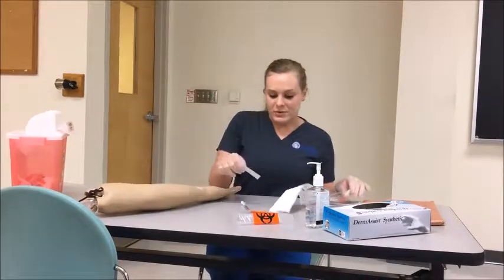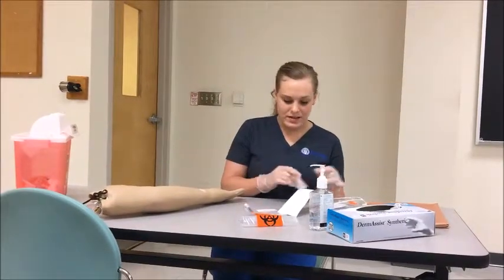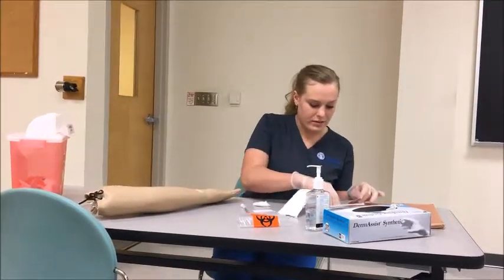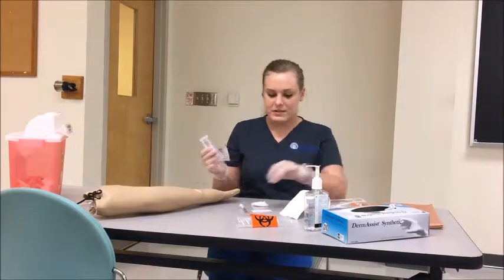Making sure I have a patient identifier with the name, the date, the time, and the temperature of the patient. And confirming I have my gauze, my alcohol wipes, and my band-aid ready.